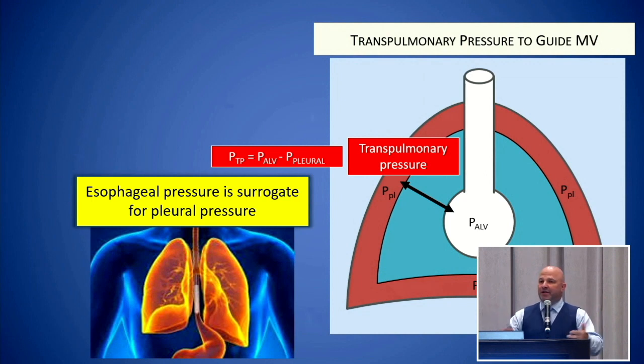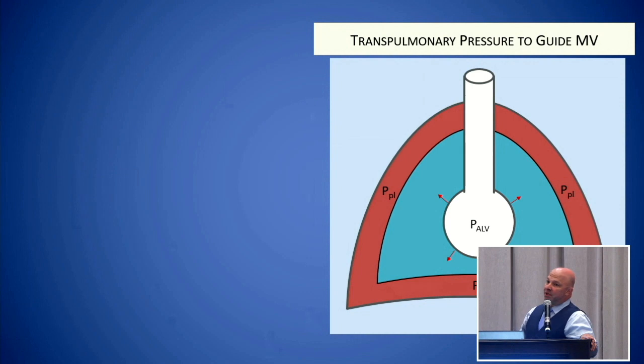However, what the ventilator can't do in terms of a plateau pressure is tell you how much is from the alveolus and how much is from body habitus or the pleural space. It doesn't give you that. It just gives you the big number. You have to drop an esophageal balloon in order to elucidate and separate the two types of pressures. Right? And so we use this a lot. I mean, we've dropped well over 500-600 balloons now. We put it in everybody now because it's eye-opening.